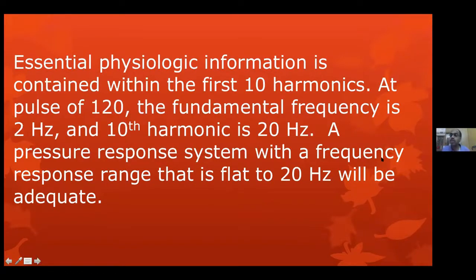There is one more question: whether this kind of overestimation by echo is there in PS also? Yes, it is there in PS also. However, in pulmonary stenosis, the distal pulmonary artery pressure is so low that we will not be able to appreciate this recovery. In an aorta, if from left ventricular pressure of 180, it drops to 120 at the level of the tips of the aortic valve and recovers to 150, that means there is a pressure recovery of 30 millimeters of mercury in an extremely small aorta, and we will be able to pick it up.